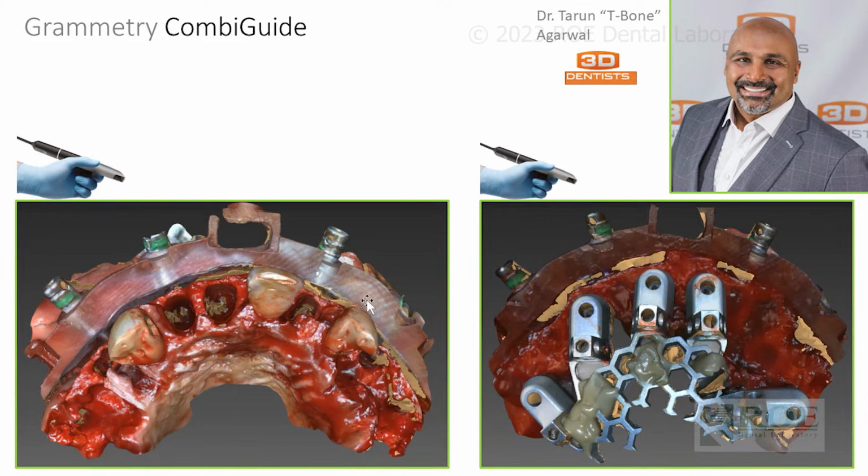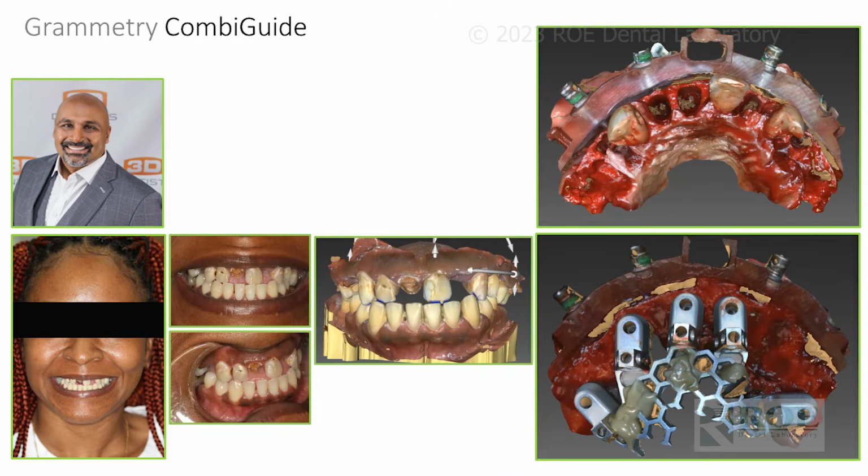So he scanned this, he extracted a few teeth, but he kept these remaining for the bite. He's a great scanner, right? So he scanned the opti-splint in the mouth with the fixation base. Fine, we made it work, no problem. But normally you would take it out. And these are the records we're working with, right?